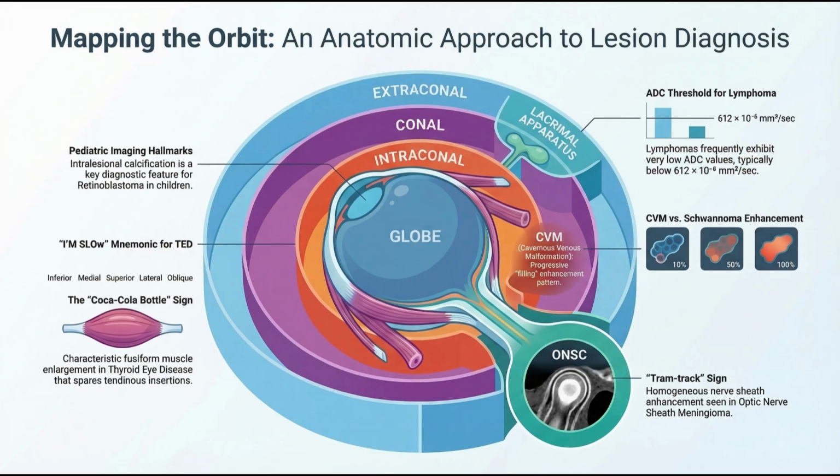Right. That spatial fact completely differentiates it from something like an optic nerve glioma. Which is different how? An optic nerve glioma is a tumor that expands the actual inner wiring of the nerve itself. Oh, I see. So the middle part would be glowing instead. Exactly. Let's follow that cable straight into the camera itself, the globe of the eye.